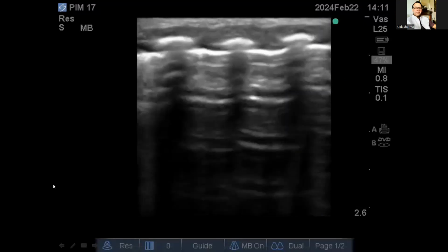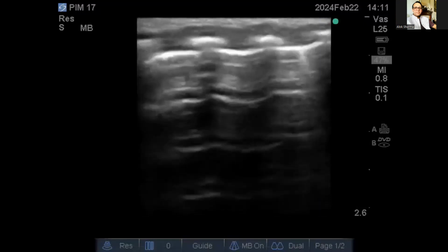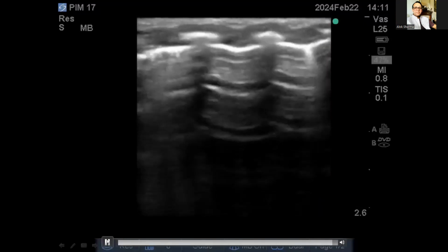Because you really want to make sure that's not what is called a bubble or an anterior pneumothorax in that region. I think for me, I can see some comet tails that move. So I'm clinically convinced they're sliding. But if you look, I think that's a double lung point.